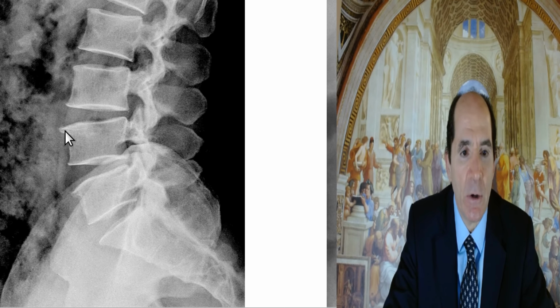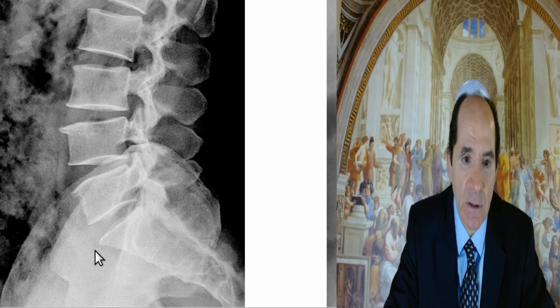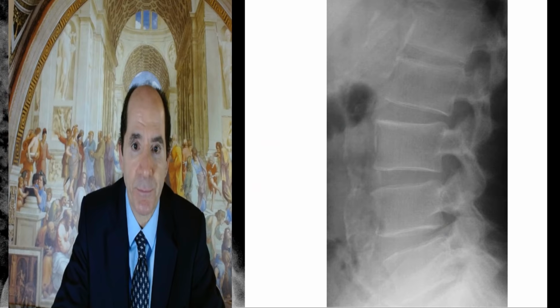Okay, here you just see a little bone spur, an osteophyte is what the bone spur is. But these disc space heights are relatively intact. Vertebral body heights are intact. Okay, the end plates are intact. Okay, then let me show you what film I was covering up initially.